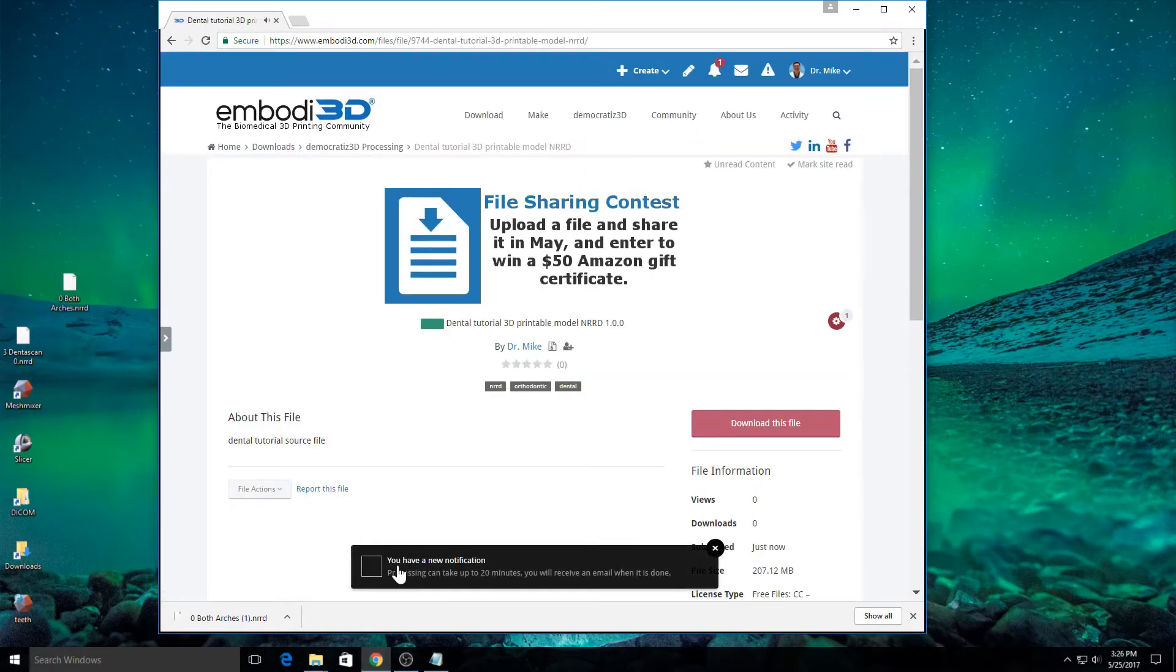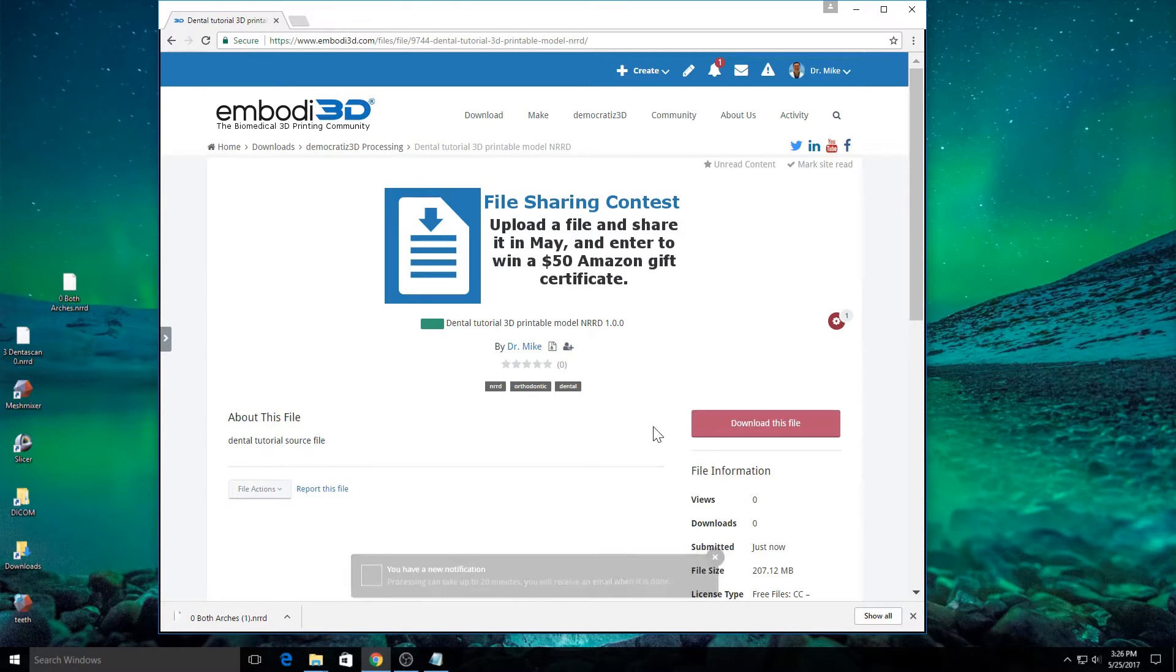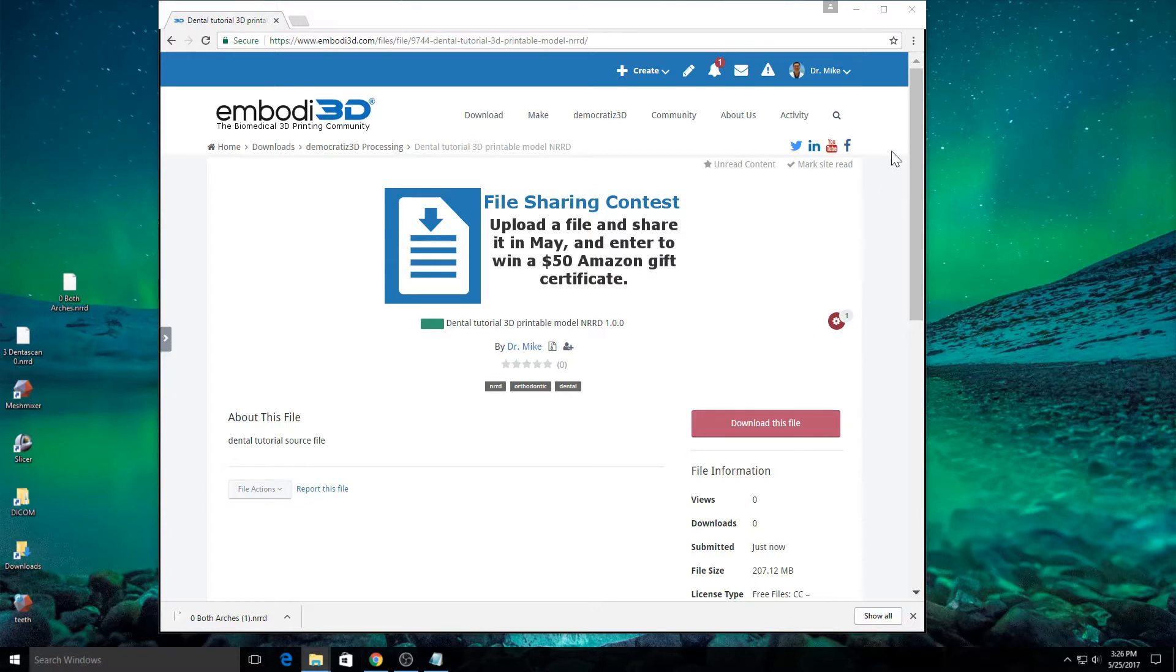The file is now 100% uploaded and I'm going to click save and submit. And it says I have a notification that the processing can take up to 20 minutes and I'll receive an email when it's done. That's great.